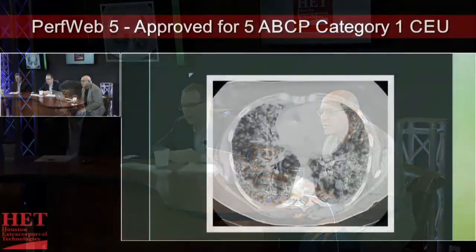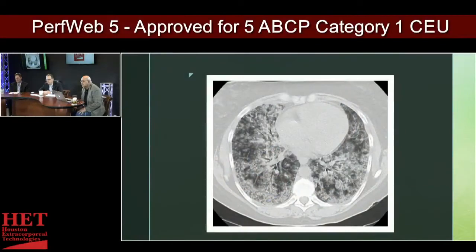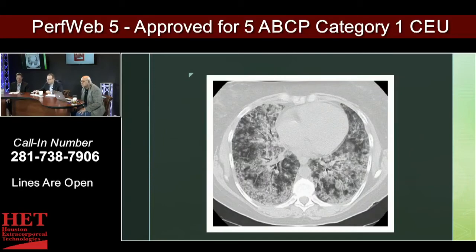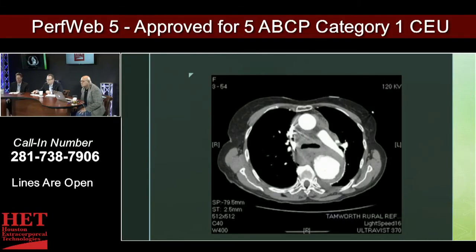This is what you'd expect on a CT with ARDS — just a diffuse pattern. It looks as bad this way as it does on the plain x-ray. You can see the cardiomegaly, and just everything is fluffed out. There's no fluid collections or anything drainable — it's not a loculated pneumonia, no PE or anything along those lines.